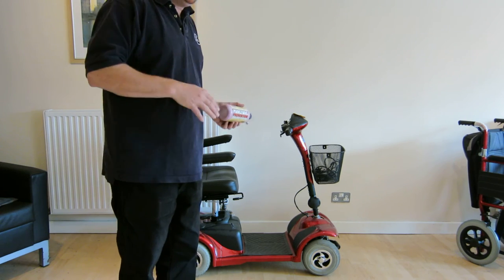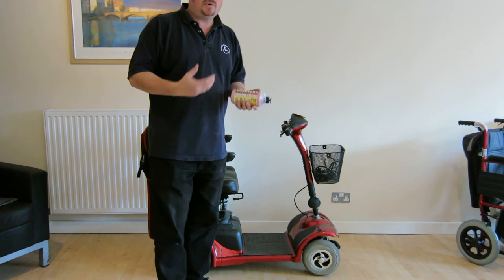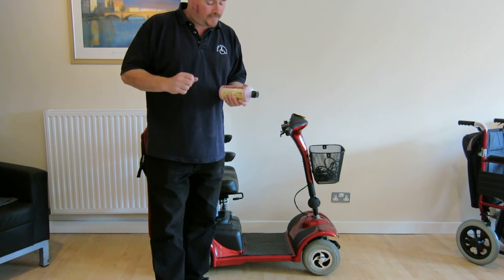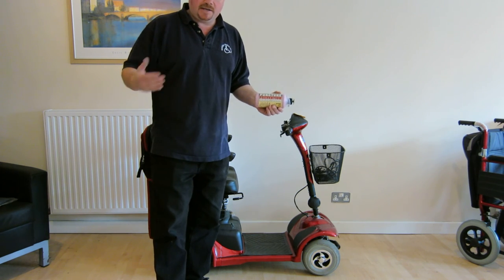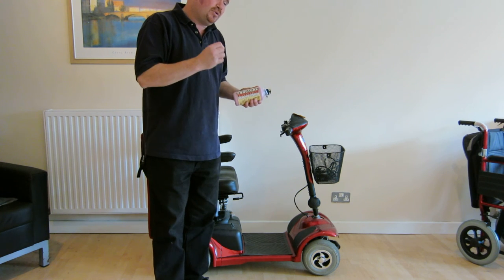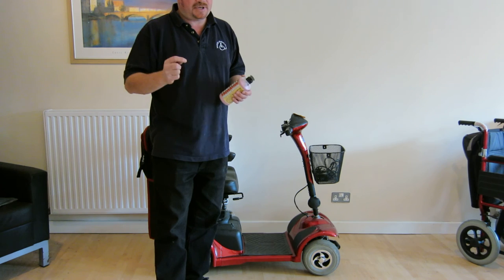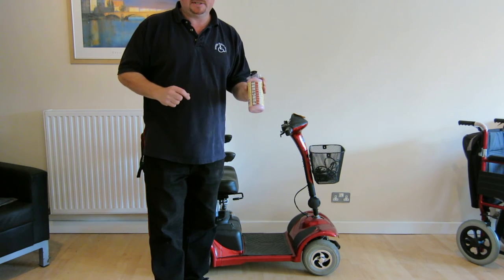It's cheaper if you put it in yourself but it does take about half an hour to 40 minutes to install it. You also need a method of reinflating the tyres once the gel has been installed. Or we can install it for you, and if you're ordering via the internet, it's protected from the minute you take it out of the box. It can protect against punctures in objects up to 6mm in diameter. What it can't protect against are slashes or cuts in the tyre. But this is our most popular selling accessory.